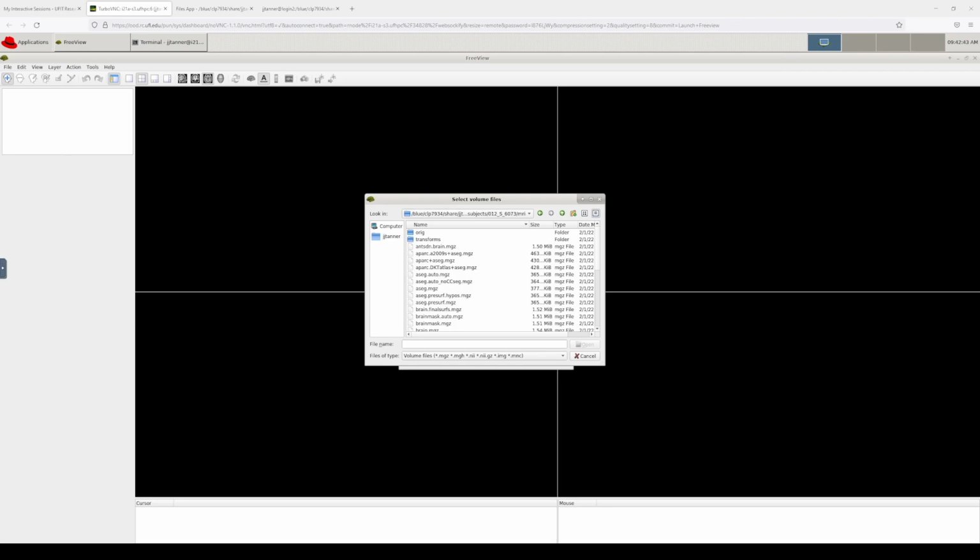What I recommend is looking at the module. What I have is a series of slides that will walk you through some of this. Again, maybe a different brain, but there'll be links to websites that you can use to go through this. There will be the PowerPoint that you can go through to follow along with some things. And the PowerPoint is still loading on my end.